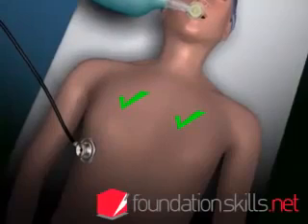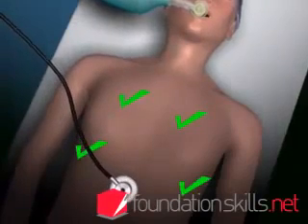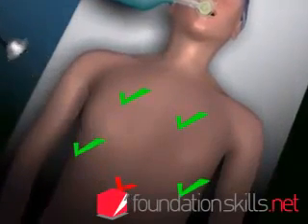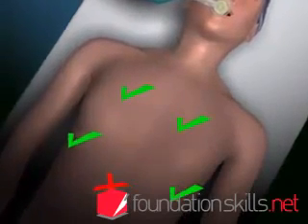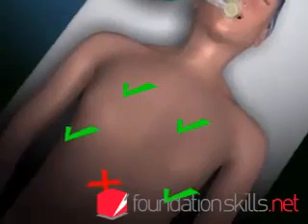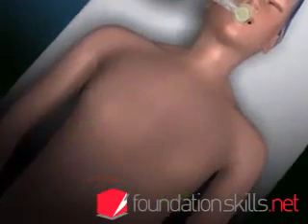and the stomach. If it is not in the correct position, deflate the cuff and remove the tube. Resort back to bag and mask ventilation and repeat the intubation process from the beginning.